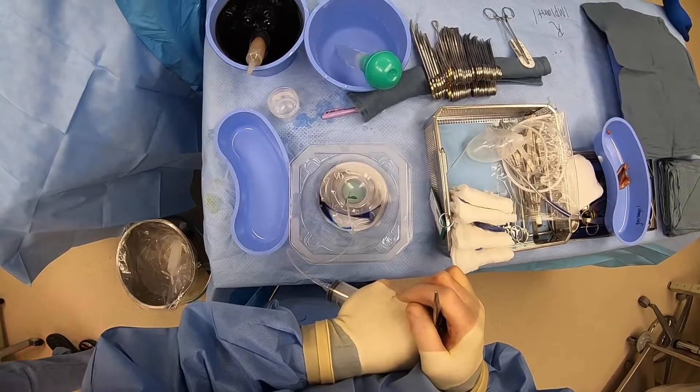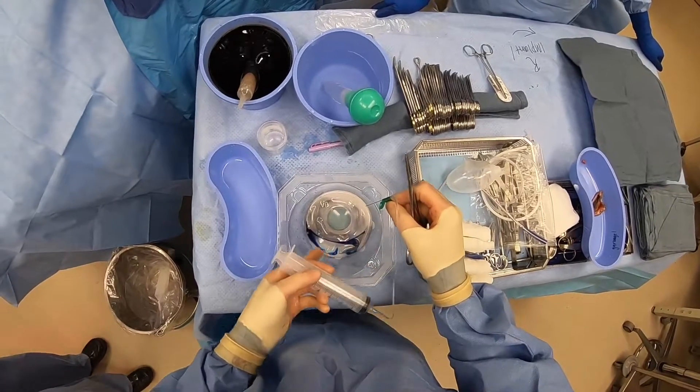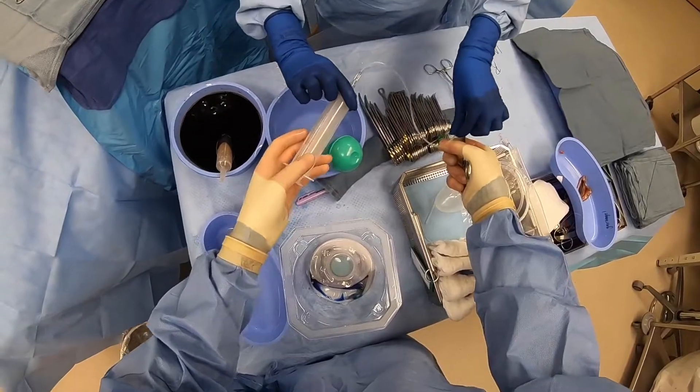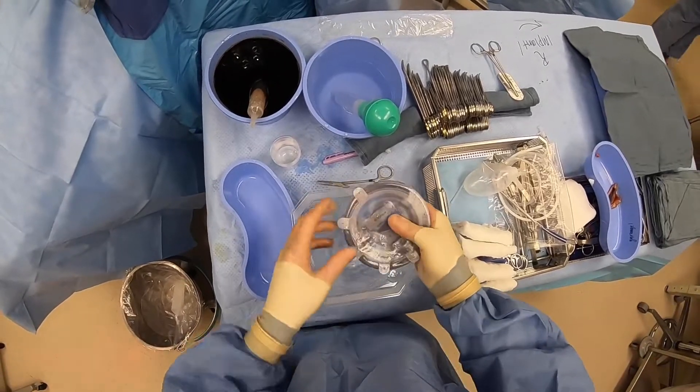The reason I do that is when we're in the office, when the nurse goes to access the port, they draw back, they get blue, and they know they're in. So that is why I do that — that's how you prepare a tissue expander.